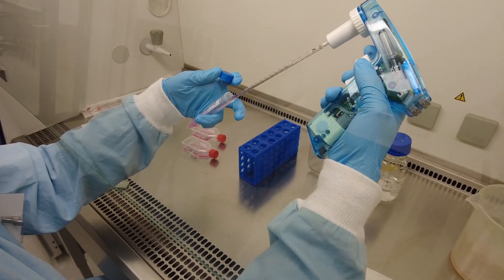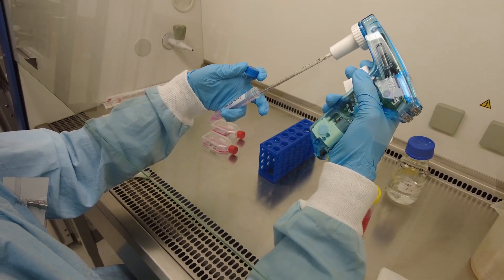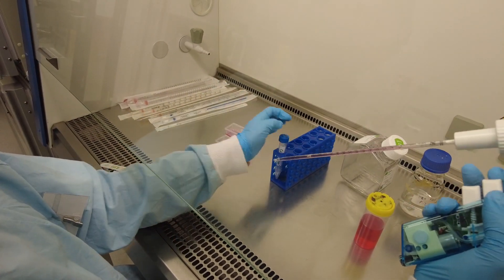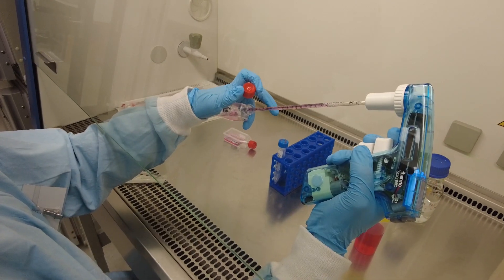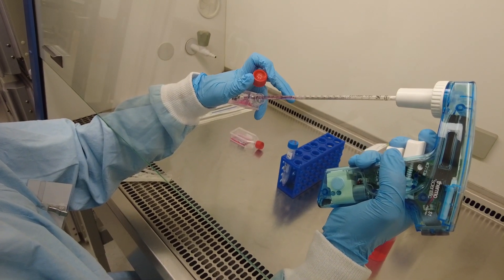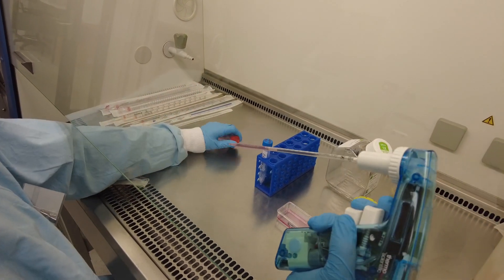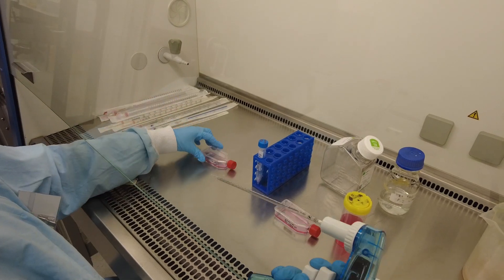What we're doing is pipetting up and down to re-suspend the cells evenly. We do this about five to ten times depending on the pellet. Then we take everything — two mil — and decrease the speed of the pipette gun so we can put one mil into each flask. One mil into that one, and then the rest into the fresh media flask.